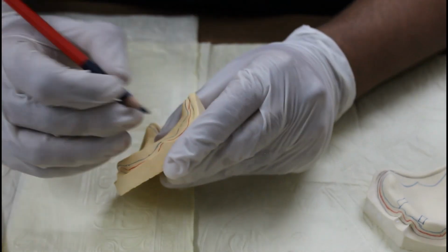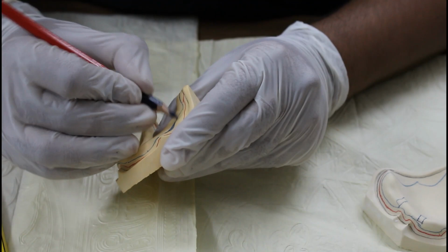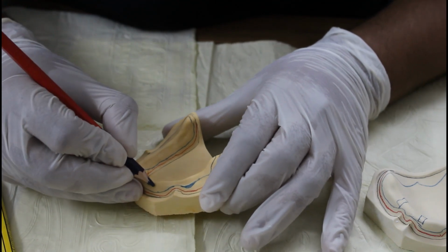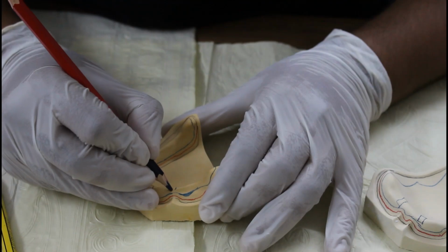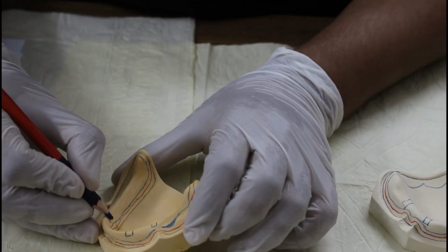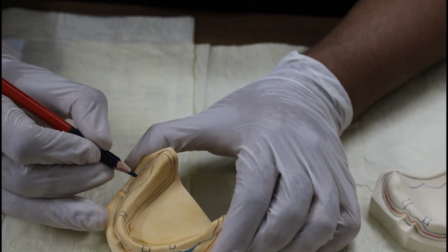And leave the buccal shelf area without covering the tray, and then make tissue stops in the canine and first molar region. For mandible, either you can make in the molar region and canine, or you can just make it in the canine region, because posteriorly the buccal shelf will also act like a tissue stop.